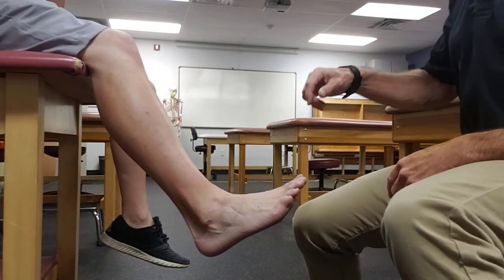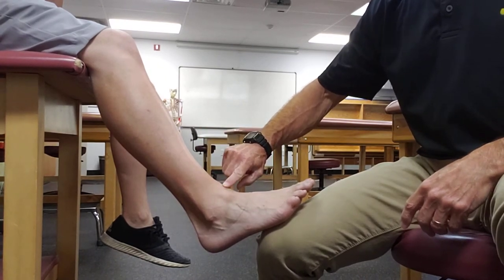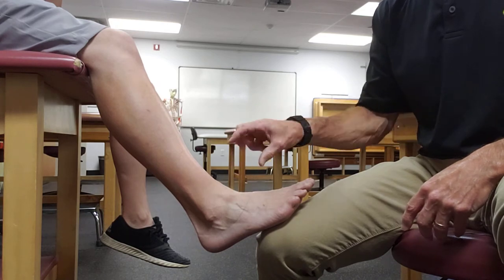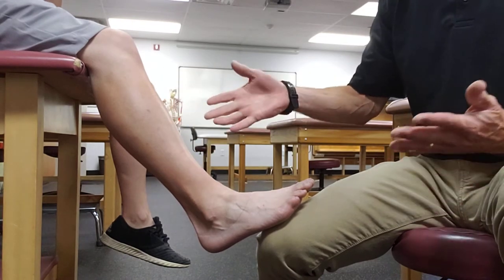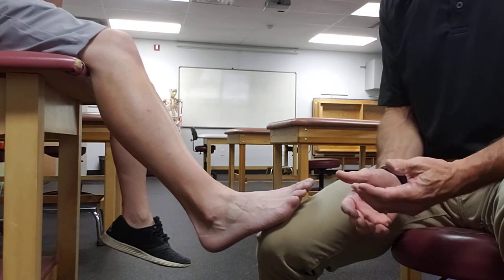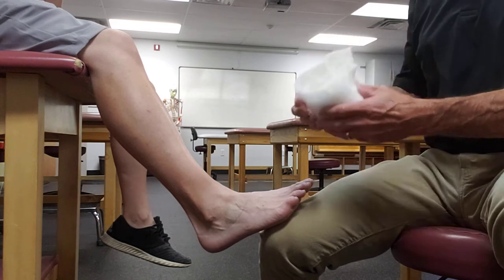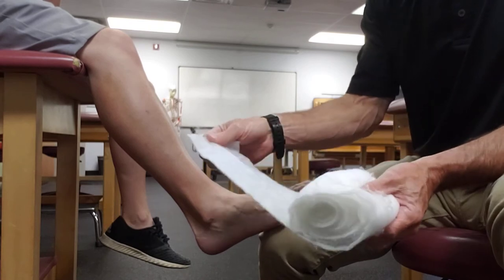The first thing you're going to do — depending on where the wounds are — you have to be careful across the top of the foot where all those extensor tendons are. If the material gets too bunched up there, it's going to really dig in and be pretty uncomfortable. So sometimes you may add an extra padding layer. If we had individual wound sites, you may put a contact dressing over the top — like a nonstick Adaptic or Telfa dressing — though you don't necessarily need them.